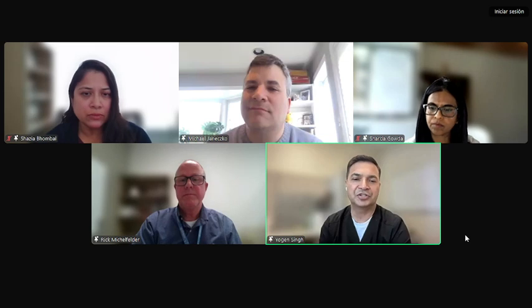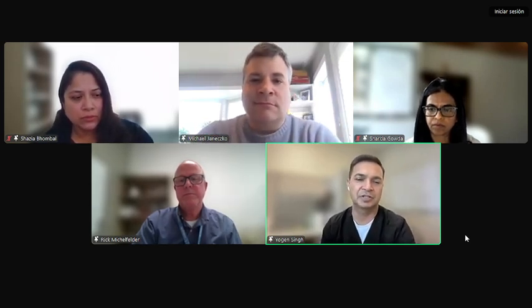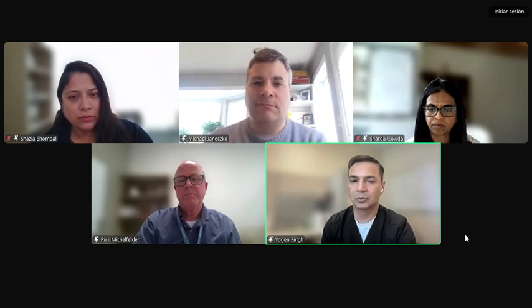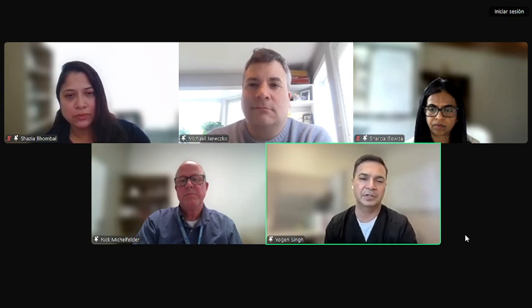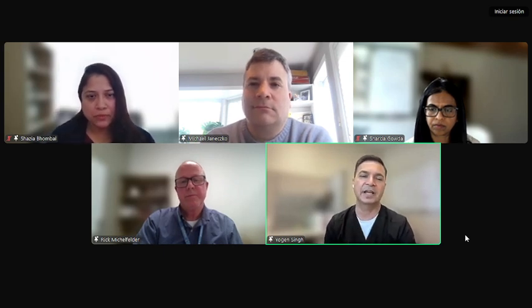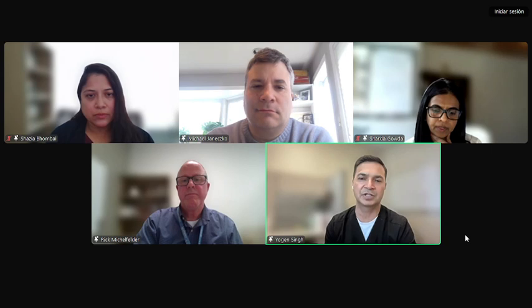Similar kind of approach really, Michael, we do here as well. So I moved to UC Davis a few months back, so we are again building the team and training program. We are training all our providers in the basic cardiac focus, and part of that is line placement, more on the line positions. As we know, it can be static or dynamic. So static, we put the line how we normally do, and they check the position afterwards.